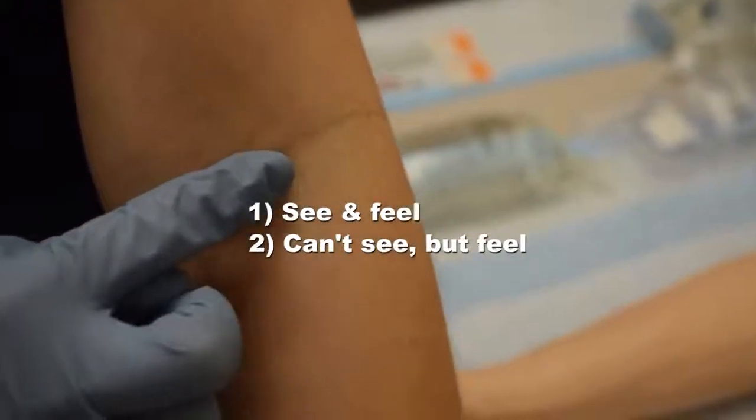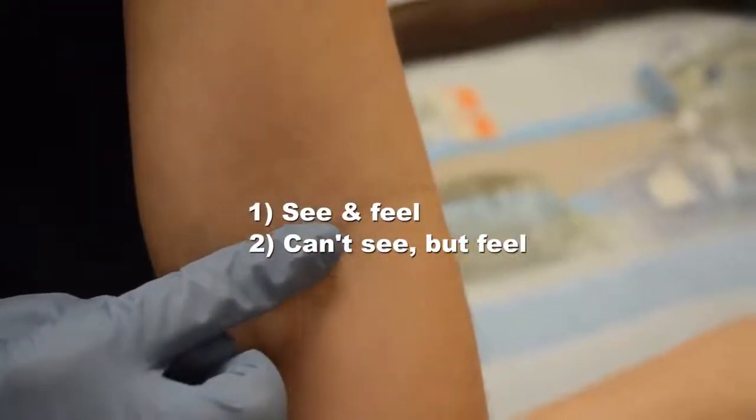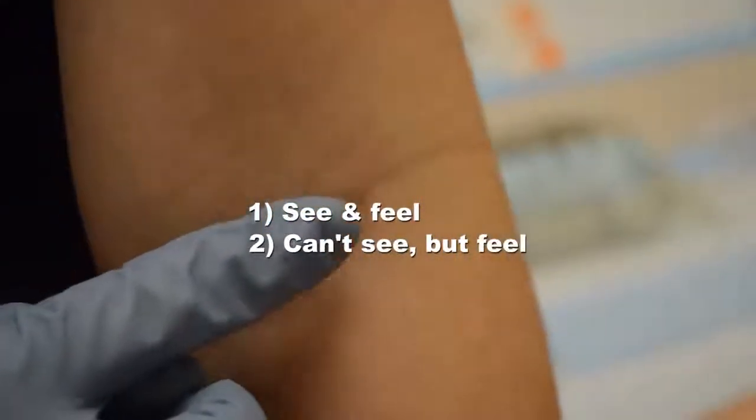Our second choice would be one that we can't see, but we can feel. So when you start moving across the arm, you start to feel a squish in the arm, and you can start feeling that circumference and that bounce back, that squish of the vein.